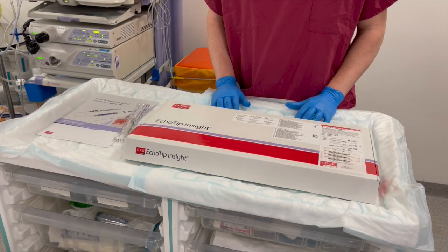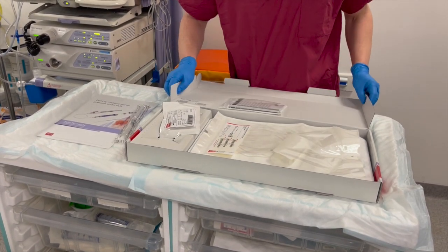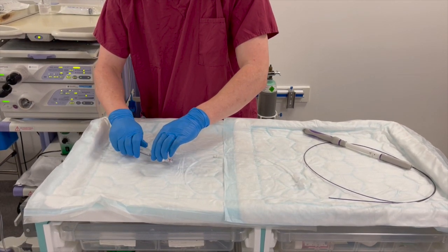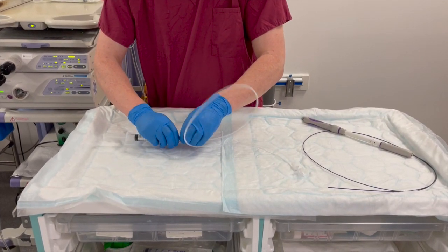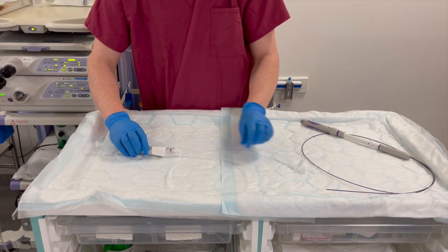Setting up is straightforward. Inside your Cook Medical EchoTip Insight box is included a small manometer, a connecting catheter together with a 25 gauge FNA needle. Turn on the manometer and connect to the FNA needle using the connecting catheter and flush through with saline, and lock the two-way tap by turning the small side arm to the lateral inlet.